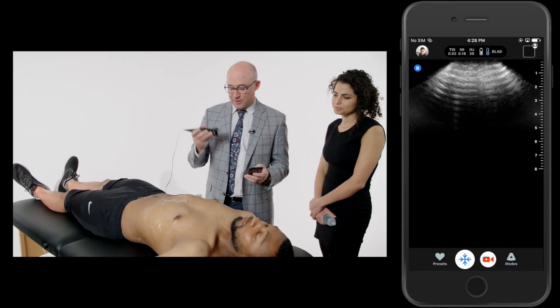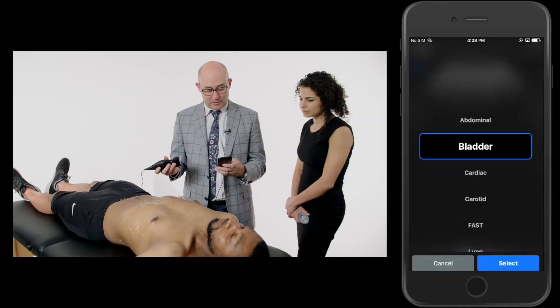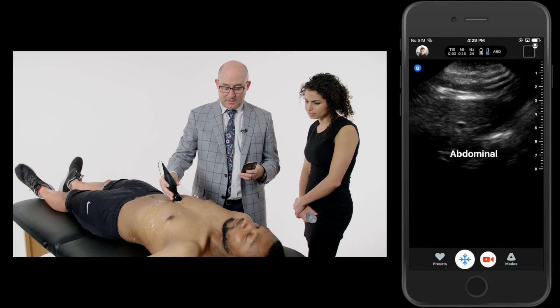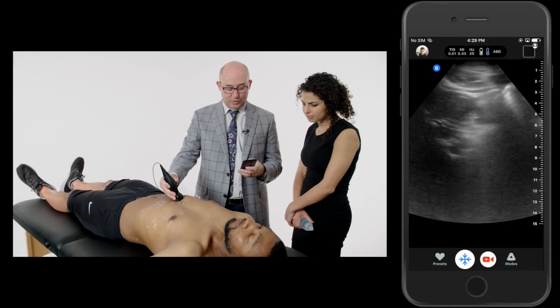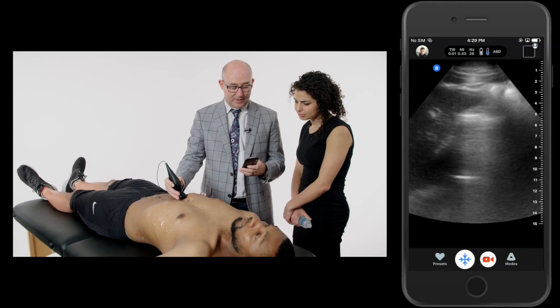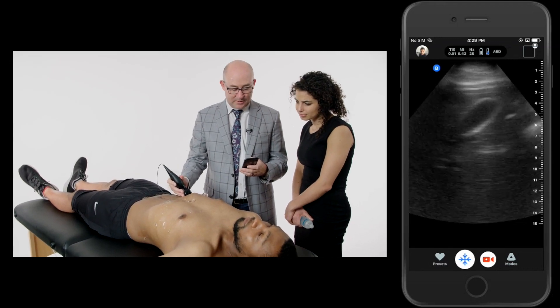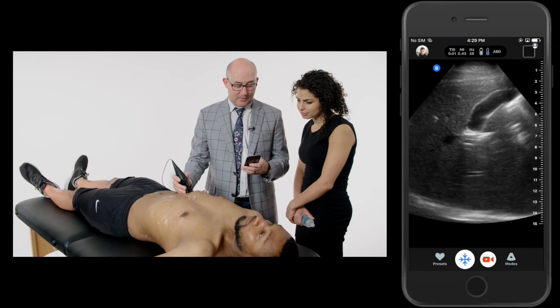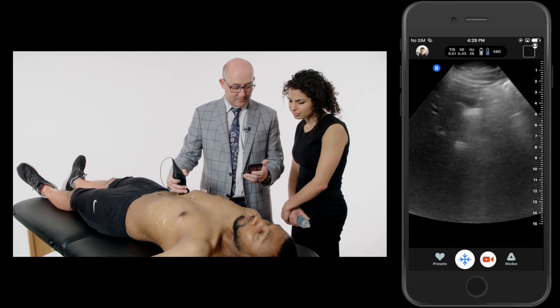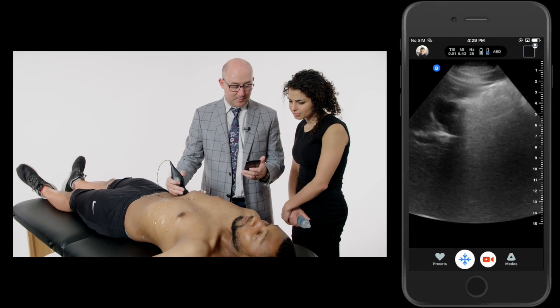From there, I'm going to go ahead and look at his gallbladder. I'm going to go back to abdominal preset and use a subcostal approach as I do a subcostal sweep. In my subcostal sweep, I'm fanning through his liver, looking for that gallbladder. Come around here and fairly up there and we're starting to see it. You can see that gallbladder in a longitudinal plane. Rotate to a transverse, fan all the way through, top to bottom.